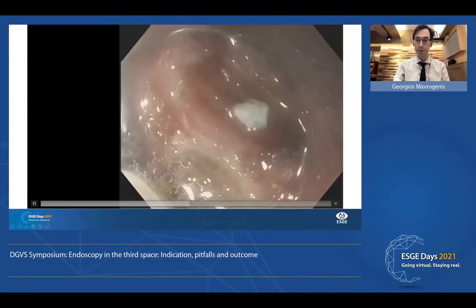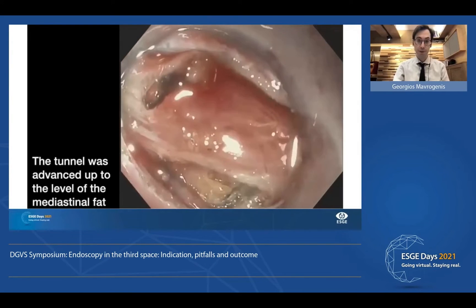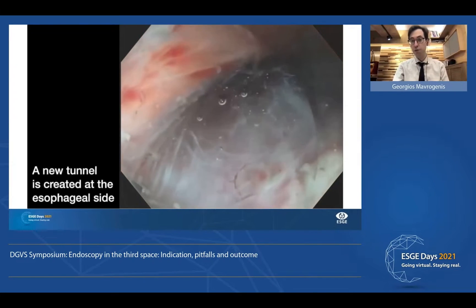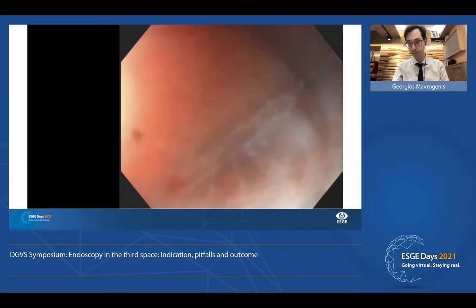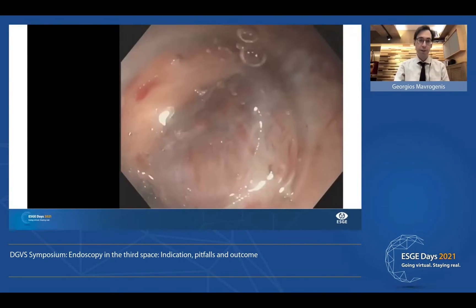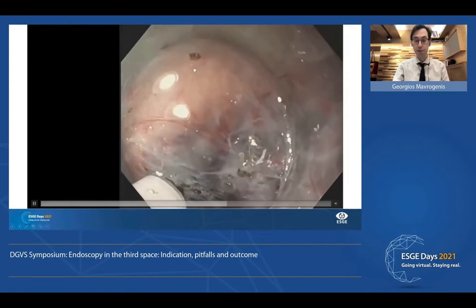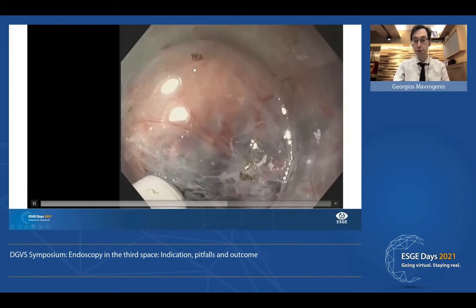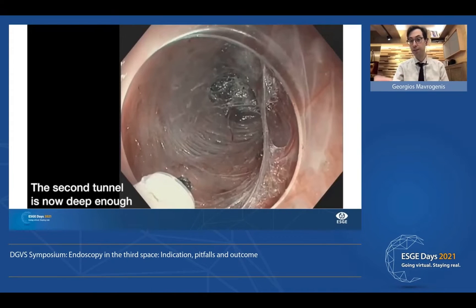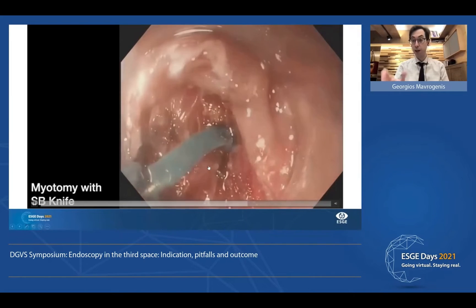We go as deep as necessary until we see fat or the last bundles of fibers. Here we see fat. Now we move towards the esophageal side where we have to create another tunnel. We work again close to the septum. We don't dissect close to the mucosa; otherwise we will have mucosotomy and then fistula, leak, mediastinitis. So here we have created two tunnels and it's time for action.